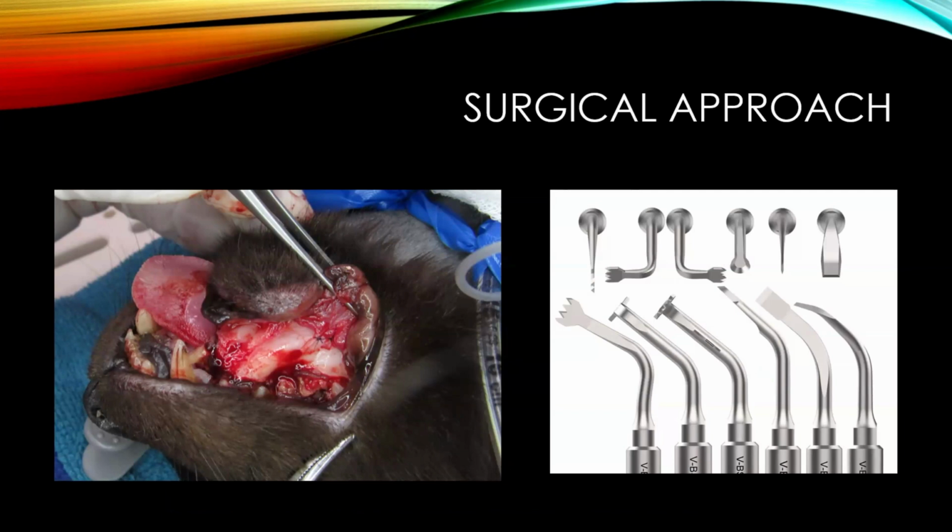And so we used a piezotome to make the caudal cut in the mandible just behind the first molar, and to section that part of the mandible. And in a cat, you can pretty much split the symphysis with a scalpel blade most of the time, remove the soft tissue attachments, and then remove the piece. Because it didn't look like there was any appreciable mandibular artery at the level of the first molar, we could make the entire approach pretty much laterally and ventrally and not have to worry about getting to and tying off that artery. So that was nice.